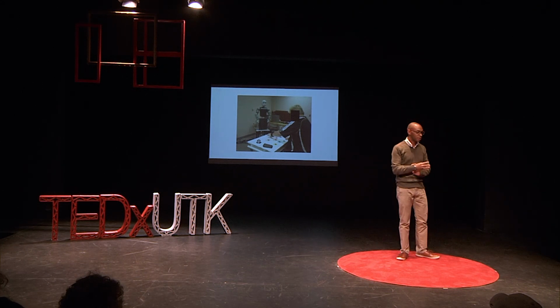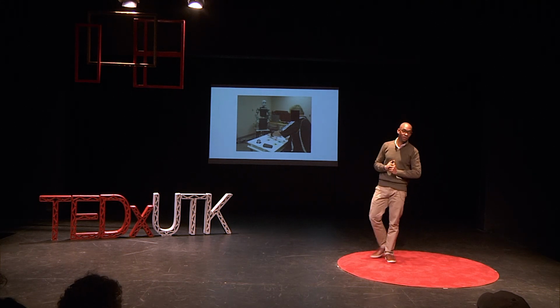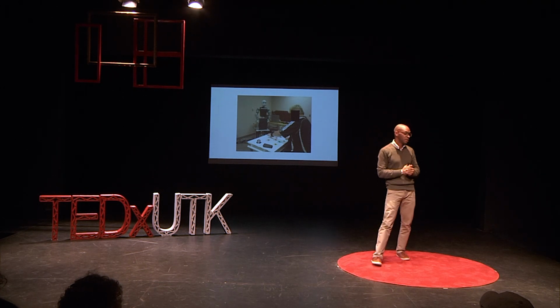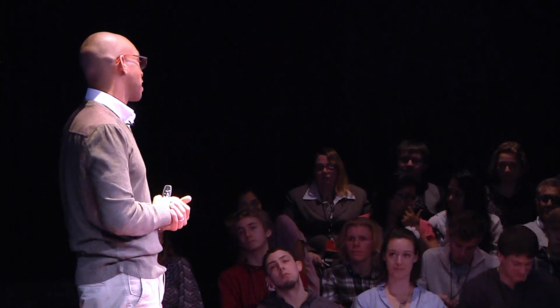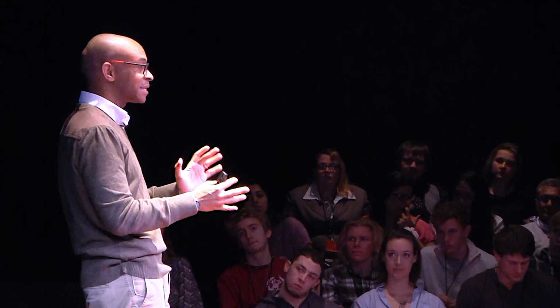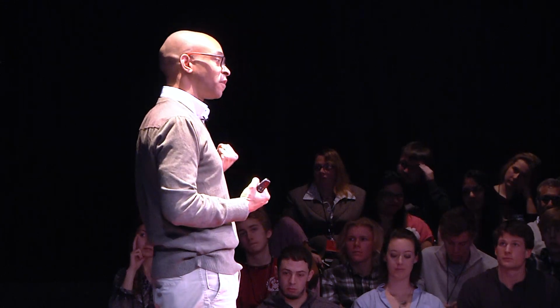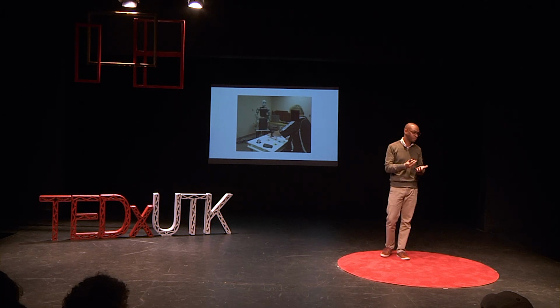to do that better. So in this study, this individual is performing a reaching game, reaching to different buttons, because the robot's saying, reach to this button. The individual tries to reach as quickly as possible. The robot's giving feedback about time, because it turns out that humans, if you tell them anything about time, want to go faster the next time, okay? So this is a way that you can sometimes motivate people intrinsically to do something when they may not have otherwise had the motivation. Now, in this setting, the robot is basically acting as the guide for the game, okay? This individual is playing the game, but nonetheless, he's doing a functional activity that forces him to do ipsilateral reaches with the limb, contralateral reaches with the limb, both of which are important for recovery in these individuals.